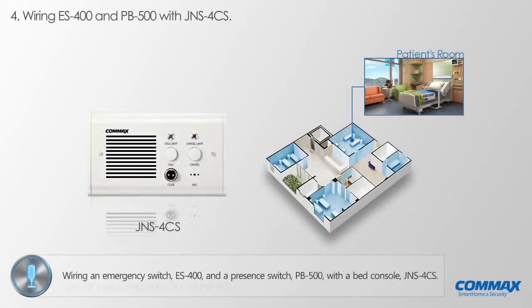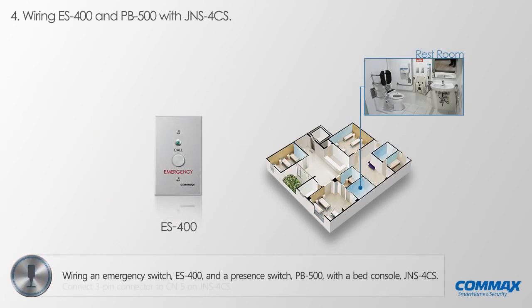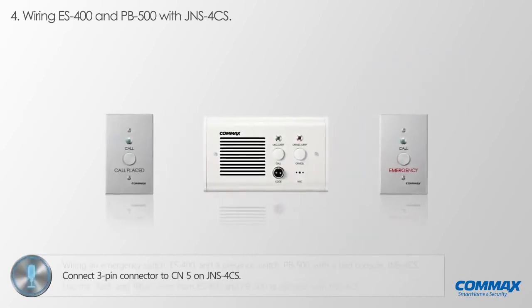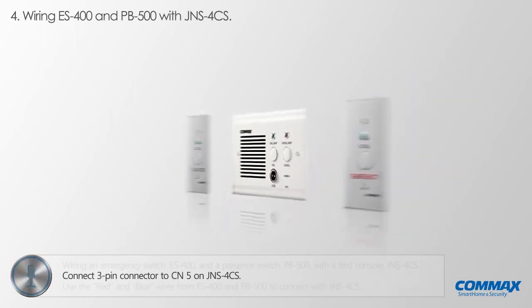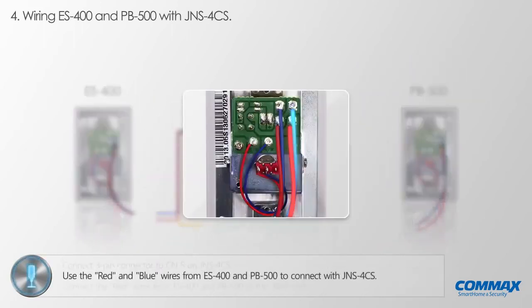We would like to show you how to connect an emergency switch ES400 and a presence switch PB500 with a bed console JNS 4CS. First, please connect 3-pin connector to CN5 on JNS 4CS. Please use the red and blue wires from ES400 and PB500 to connect with JNS 4CS.